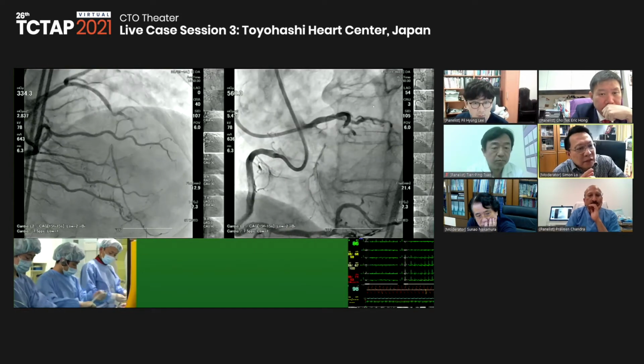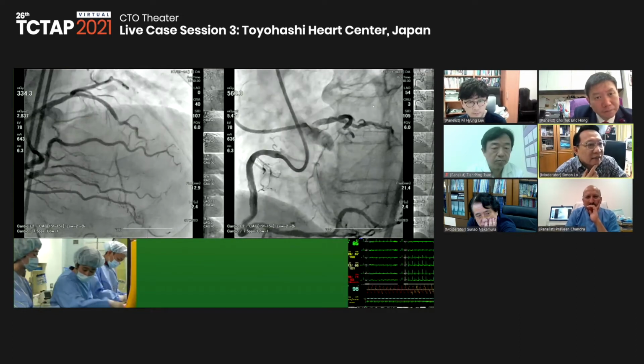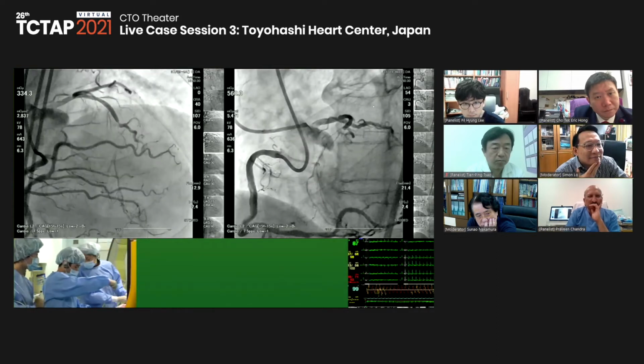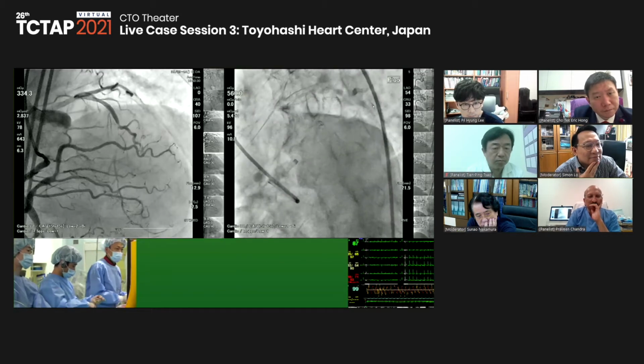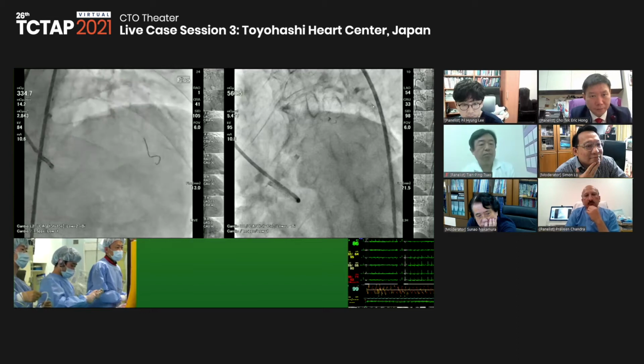Is there a little bit of a stem, like a little bit of the channel that you can see after the diagonal? Yes, but the channel begins very distal of the bifurcation, right? Yes. So that means maybe the selection is not easy.